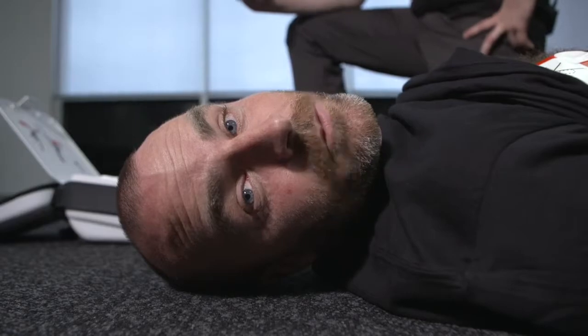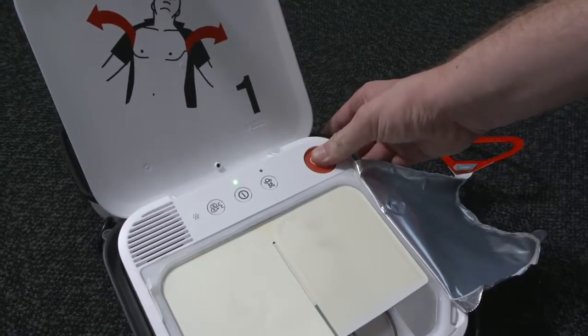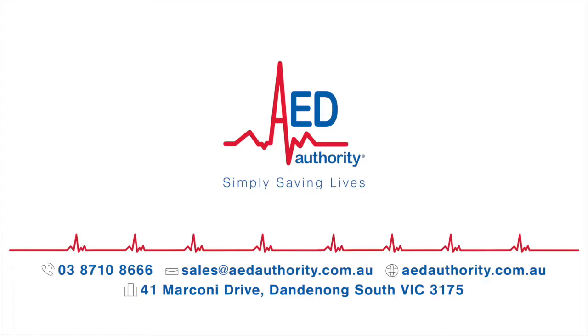Some people are afraid to use a defib. They think they might do more harm than good. But fortunately, a defib will only give a shock if the heart needs it. Watch this. Daniel, press a button. Try to shock me. As you can see, it doesn't give me a shock. They are perfectly safe, they're easy to use, and they save lives every single day.